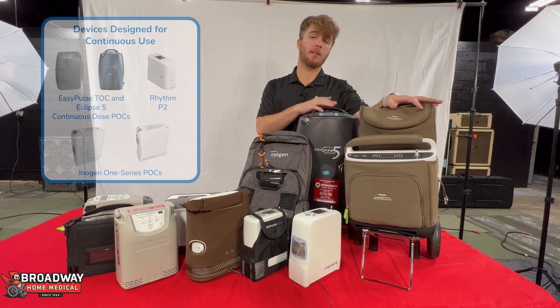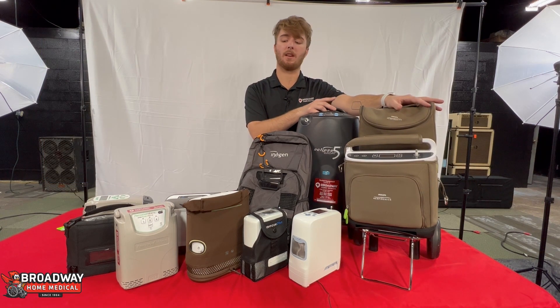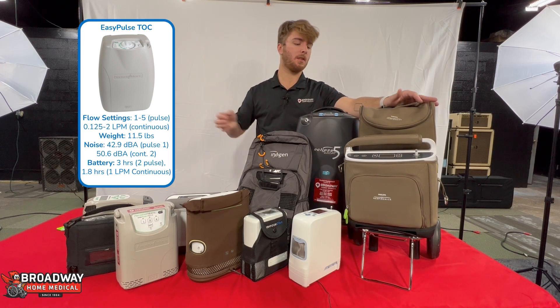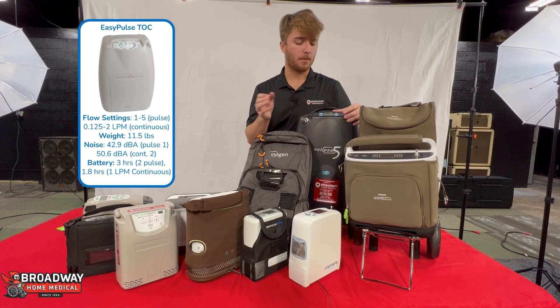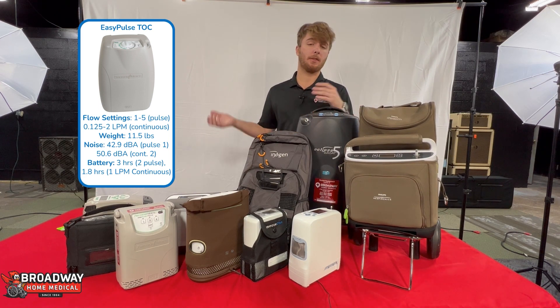And finally, we have some of our continuous dose POCs right here. We are missing the EasyPulse Total Oxygen Concentrator TOC, but we'll have some information about that. The TOC is really nice because it has a lot of the same options as the Eclipse 5, but it is a little bit lighter.